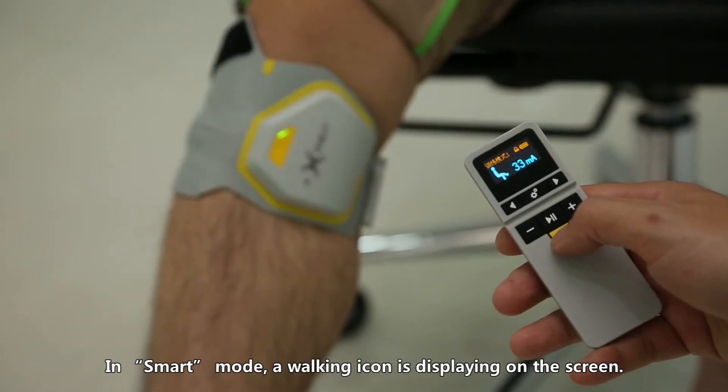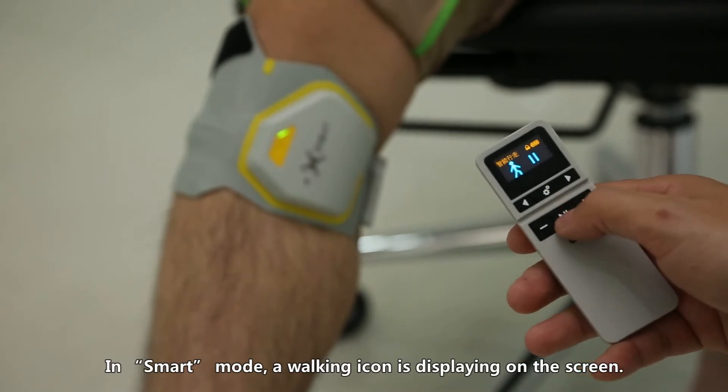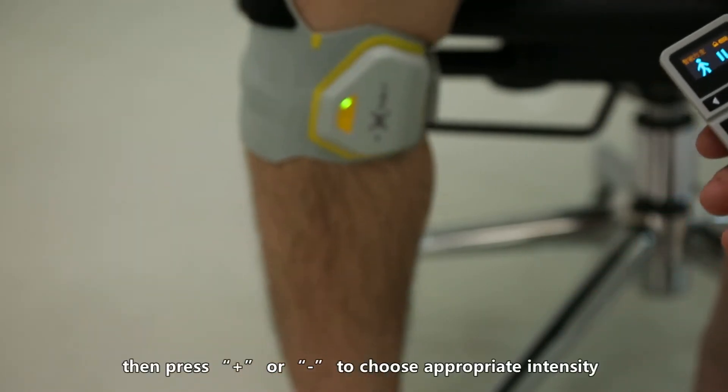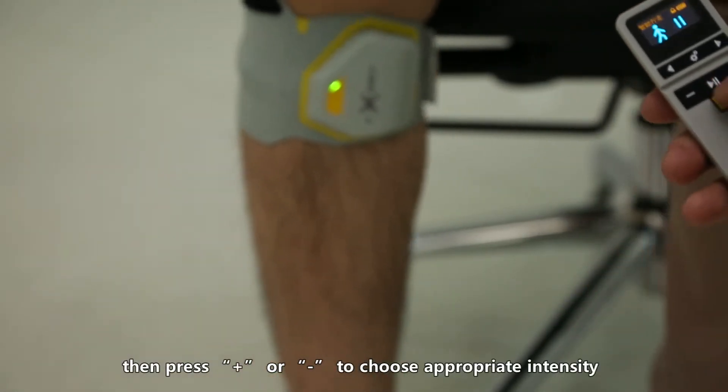In smart mode, a walking icon is displayed on the screen. Press the play/pause button to start, then press plus or minus to choose the appropriate intensity.